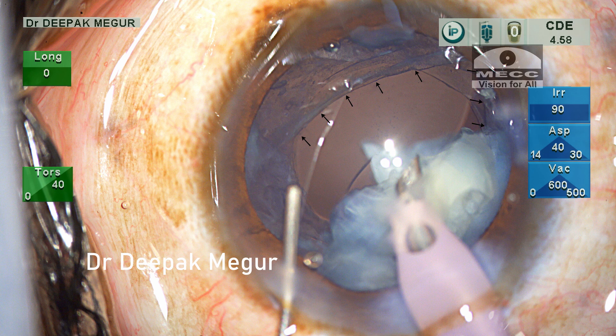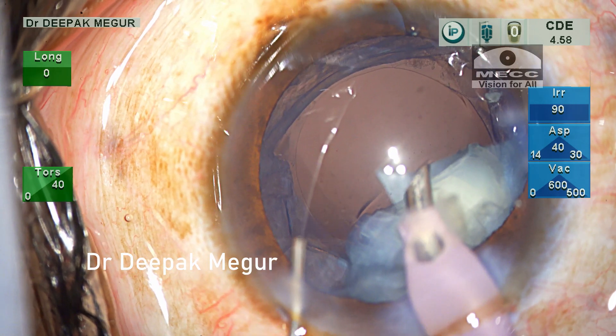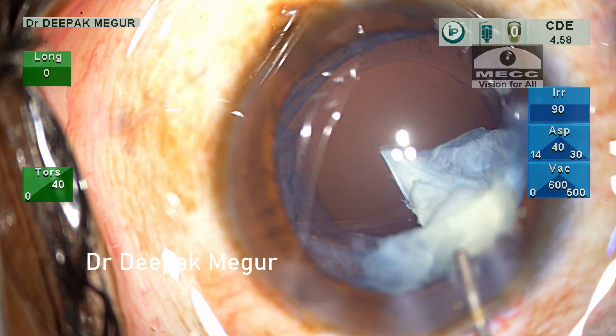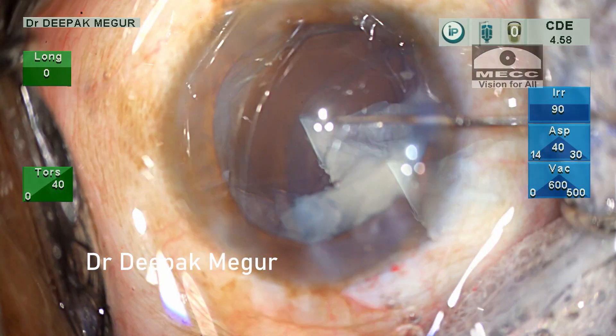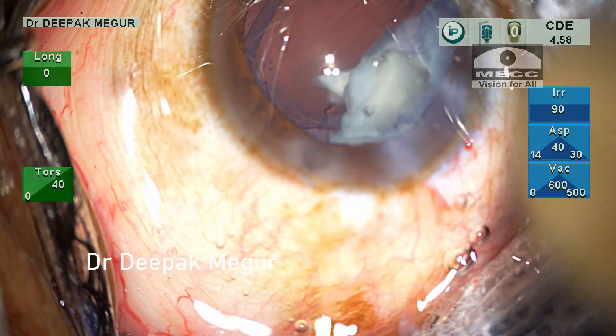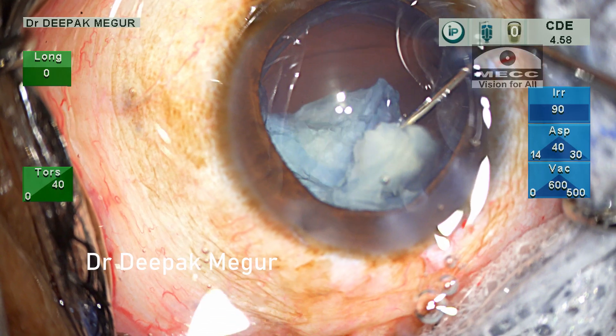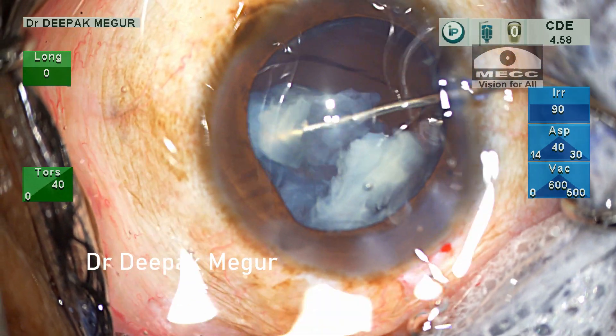Now the visibility is good — it is crystal clear. A large PC tear is staring at me. My first priority is to prevent the nuclear fragments from dropping down. One fragment is above the rhexis and the other is below it. It is gently manipulated anteriorly above the rhexis margin. At this point I am contemplating whether I should put in the lens to use it as a scaffold and then phaco these fragments.